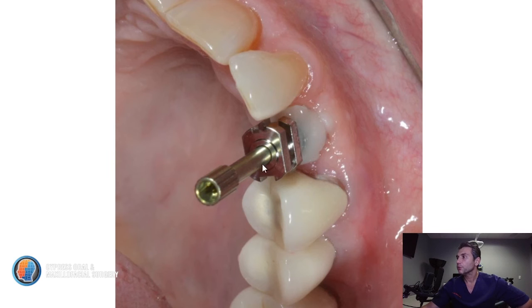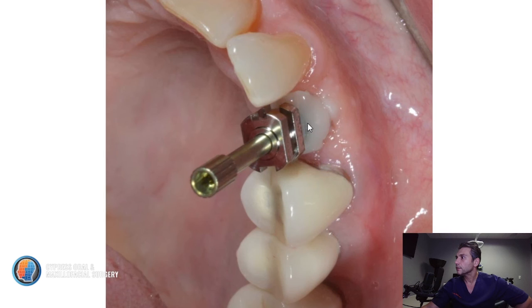Here's another view. Again, you want to make sure that your composite is 360 degrees all the way around, and you're relaying proper information to the laboratory. So doing every step correctly is very, very important.